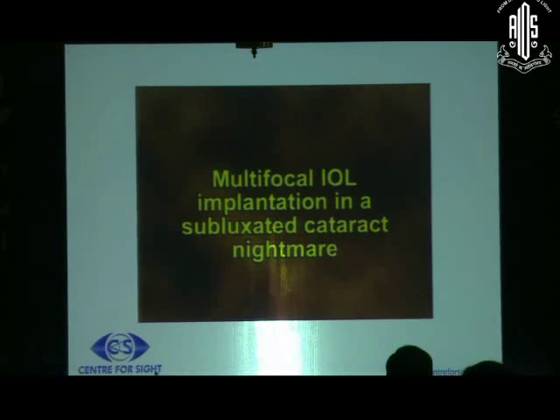Just a word of caution that I wanted to tell you: when your tension gets released, thinking I have done everything, it's at that particular time, the last moment of doing your IA, or in this case putting a lens, and you just saw the jerk with which it went. So it's always better to have a screw type injector because you never get these jerks. I still remember I had a live surgery that I was doing on a femtosecond, and the pressure was high, and I didn't have much of a problem there, it didn't rupture, but it can do that.